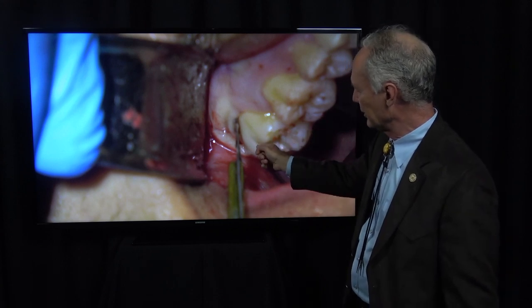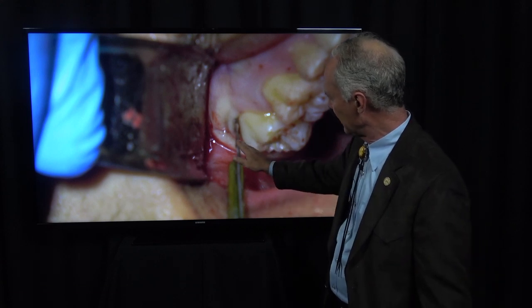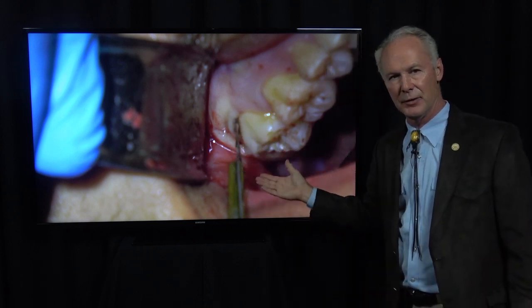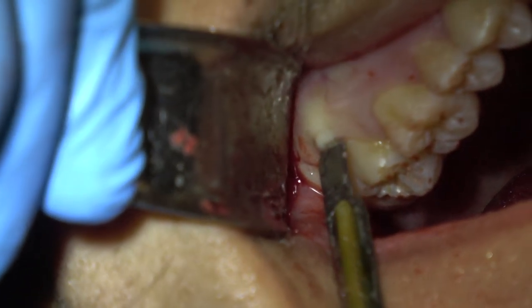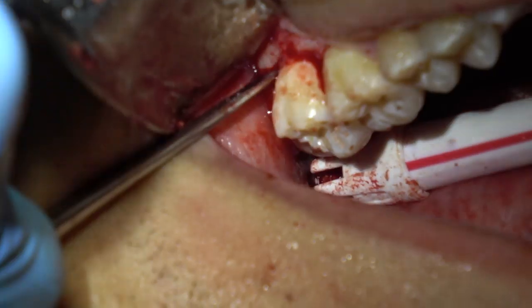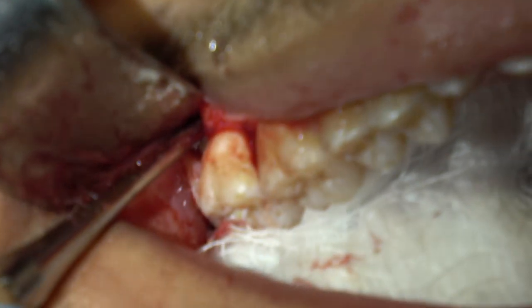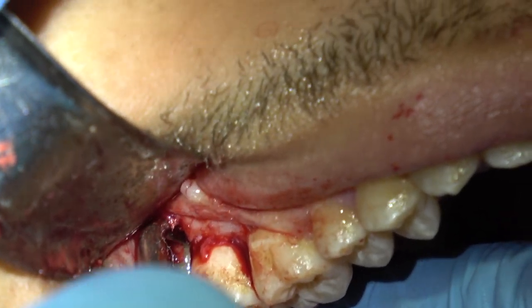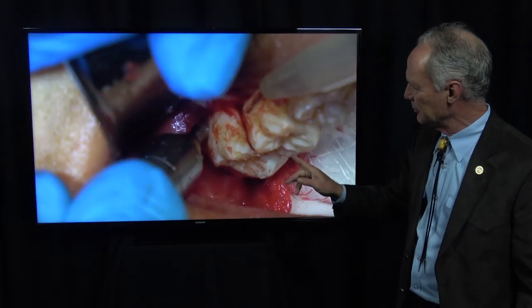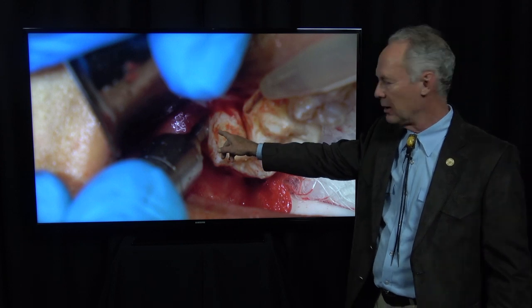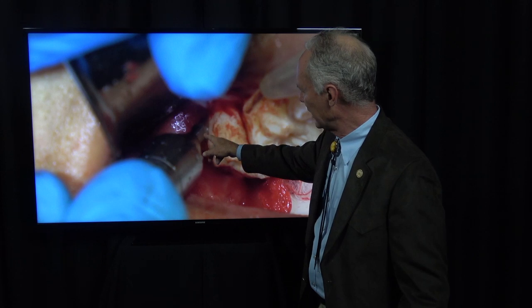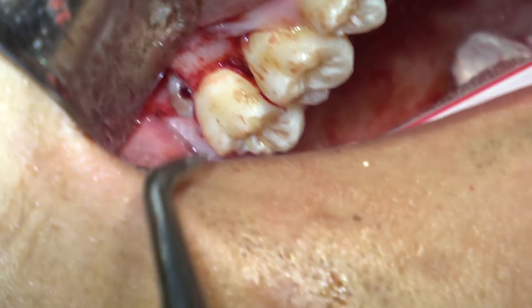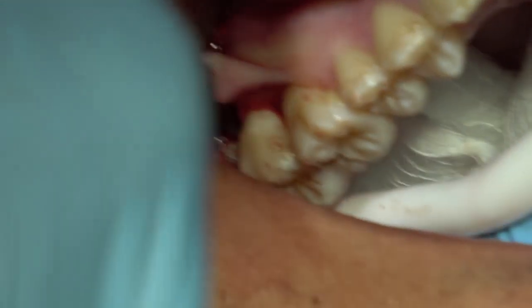You can place a periosteal elevator or another elevator in the space between the second molar and the wisdom tooth and just lift it out of there. Be sure you protect the airway with a 2x2 or the back of a mirror. This tooth was pretty impacted, so I'm reflecting the tissue from the mesial of the second molar back and placing the periosteal elevator, then the 301 elevator. Since this tooth was not coming completely out, I'm using the 703 long shank surgical burr to drill a hole in the mesial facial, and then I'll place the E8 elevator in that hole and just lift it out.